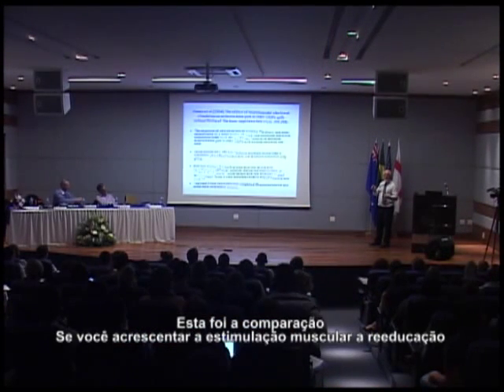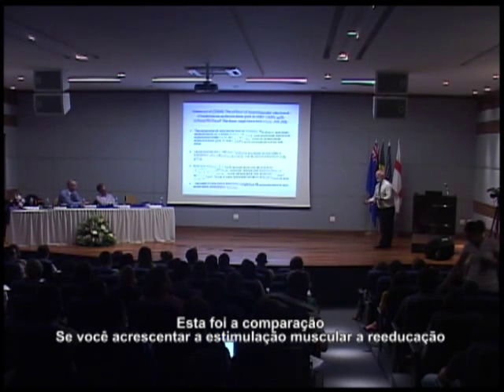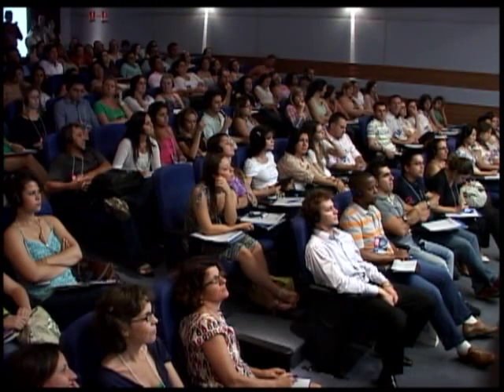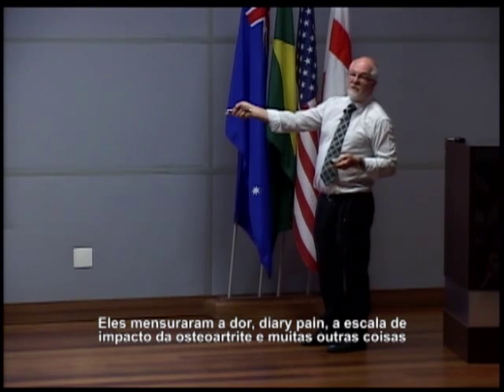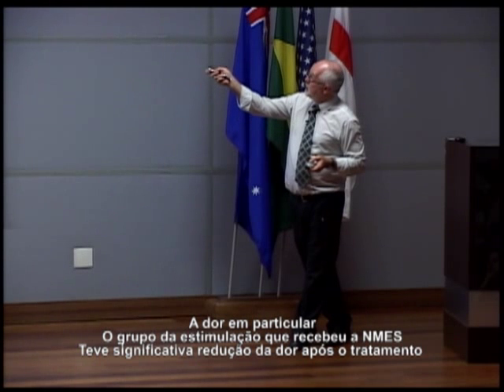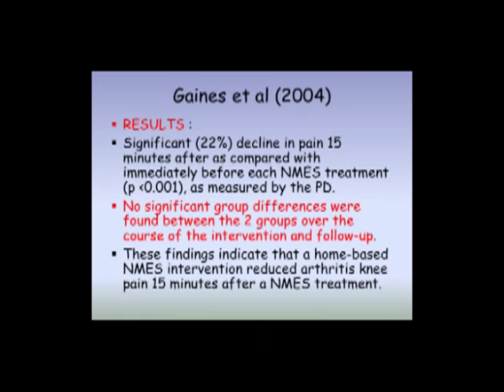That was the comparison. If you add muscle stim to the education, does it give you a better outcome? That was their research question. They've measured pain, diary pain, arthritis impact scale, a lot of things, all right? Mainly pain. The stimulation group, the ones who get the NMES, have a significant reduction in pain after the treatment.